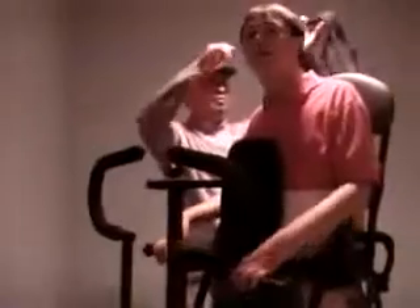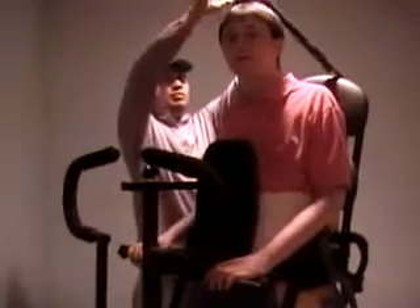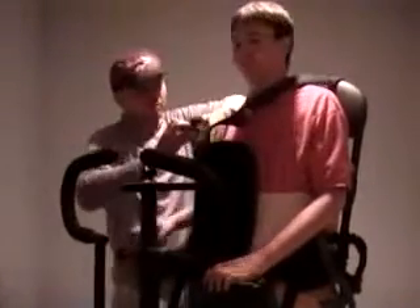If a spasm does occur, stop the pumping until the spasm goes away. Once the spasm stops, continue until you are in a standing position.